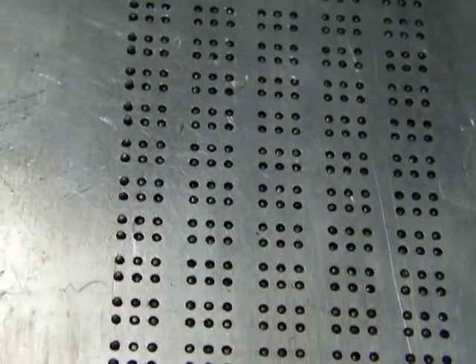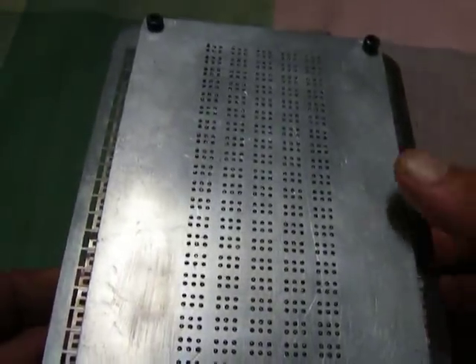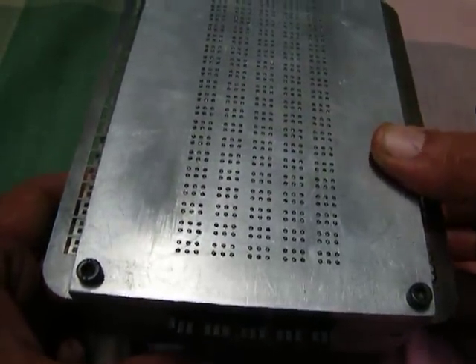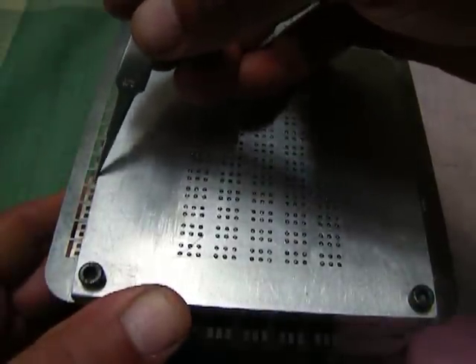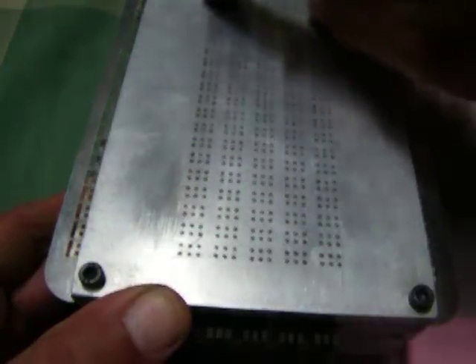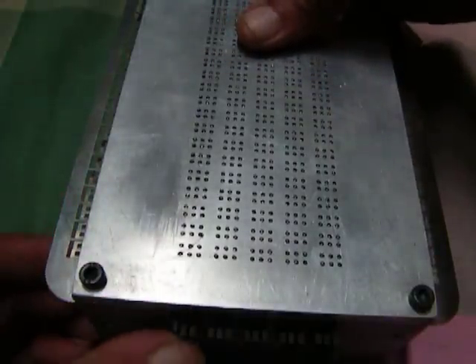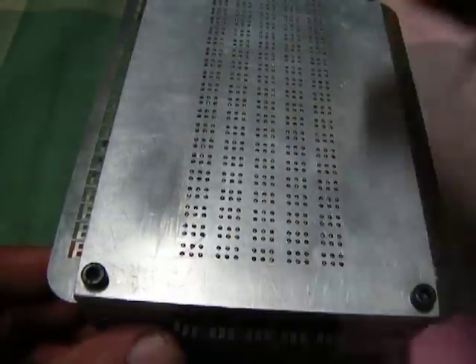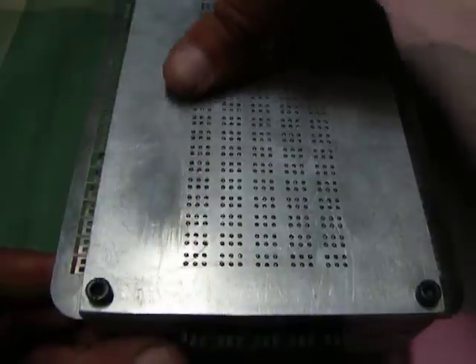Now what I'm going to do is zoom out again and show you a little more of how those row actuators work. So you've seen that only the pins in the columns that are actuated have actually jumped up. And now when I deactivate that particular one, if you can see, there's just about a millimeter of movement over here on the actuator. So from the other end, I'm going to release those pins. You should be able to see the rest of the pins falling.